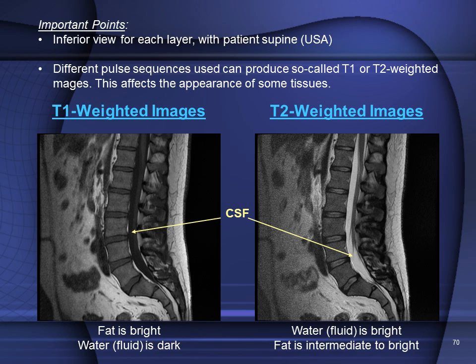On the T2 weighted image, if we also examine the intervertebral discs, we can see that they have varying degrees of brightness. This is because the intervertebral discs are hydrated, and as we grow older, they become dehydrated. Different discs have different levels of hydration, and this is suggestive of degenerative disc disease that can lead to disc herniation.